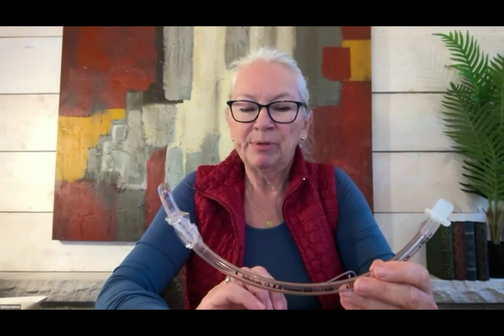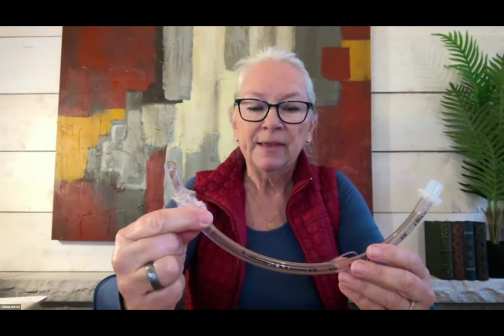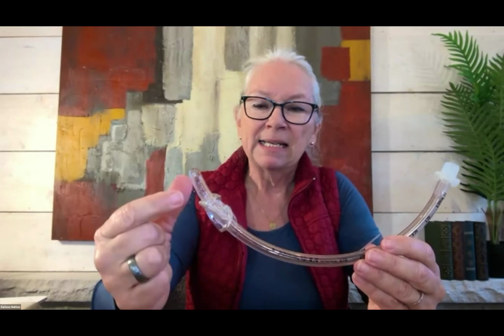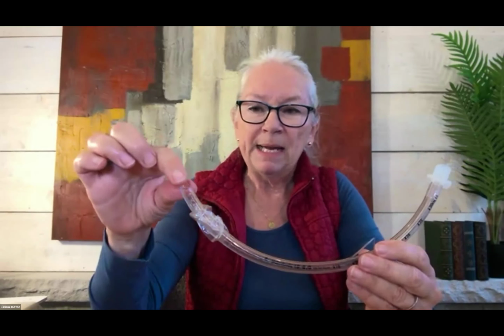This is the most definitive because it provides the best protection against aspiration. This tube will go past the pharynx. It will go directly down into the trachea, and the air will be coming out of here and into the patient's lungs.